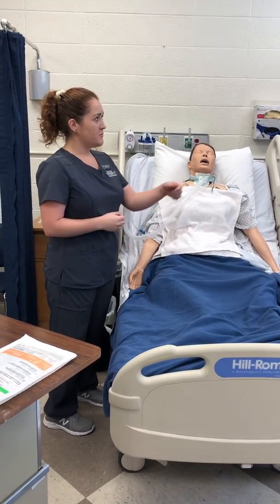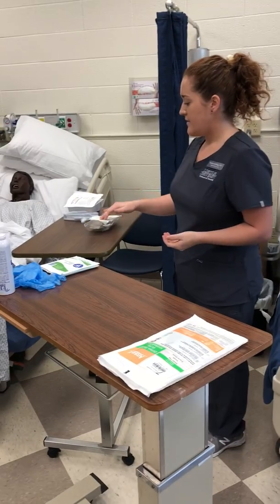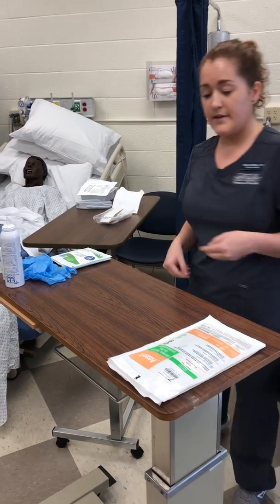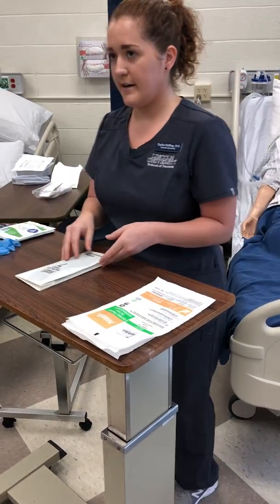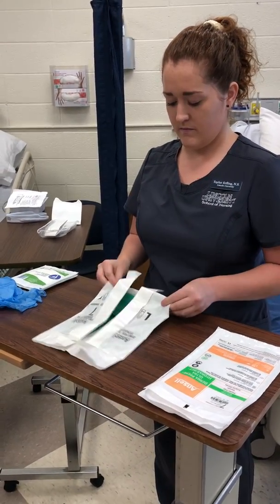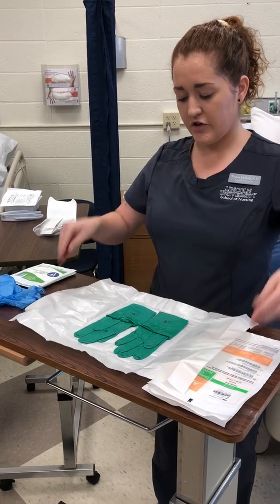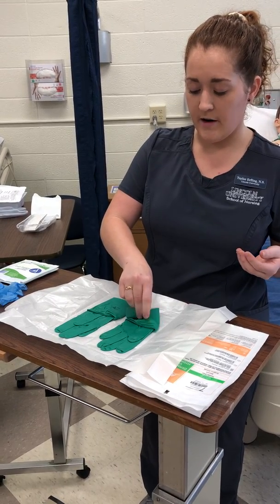Before we begin, I'm going to provide patient privacy. I'm going to perform hand hygiene and then open my suction catheter kit. I also have a set of sterile gloves I'll be using. I have also explained to John the need for getting suctioned and performing trach care to help improve his oxygenation and respiratory status.